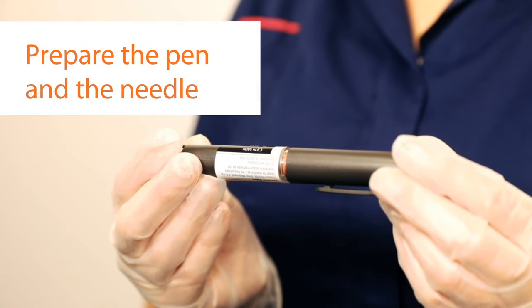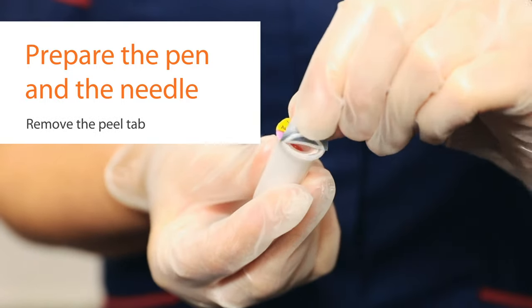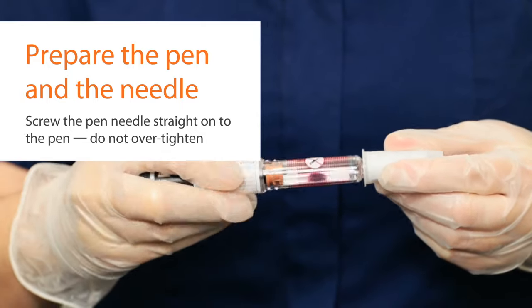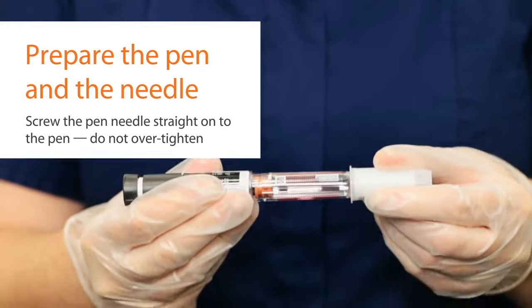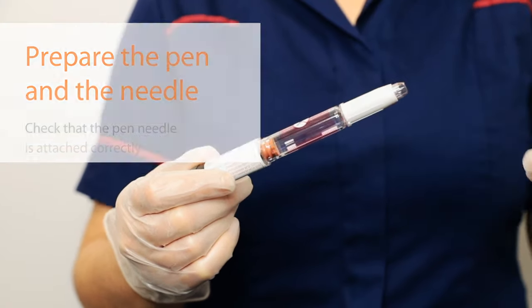When the patient is ready, prepare the pen with the needle for injection. Remove the pen cap, pull the peel tab off the pen needle, and holding the outer cover, screw the pen needle straight onto the pen just until you feel resistance. Do not over-tighten. Remove the outer cover and check that the pen needle is attached correctly.